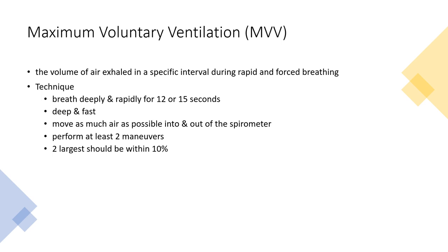All right, last test I believe that we'll talk about is the maximum voluntary ventilation. This is everybody's favorite test to yell at the patient about. This is where you have them breathe deep and as fast as you can for 12 to 15 seconds. Deep and fast. Really deep, really fast, at least as much as you can get the patient to do it. They want to move as much air as possible in and out of the spirometer.